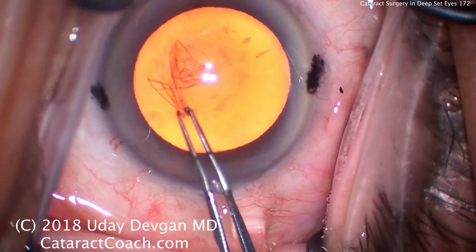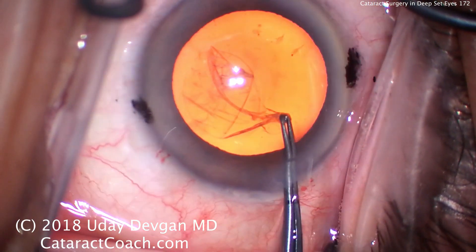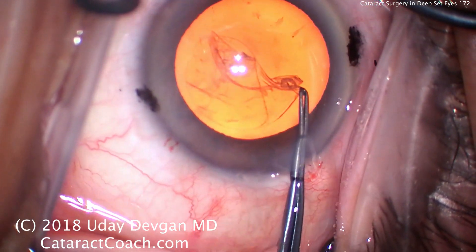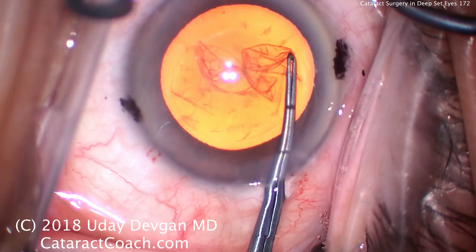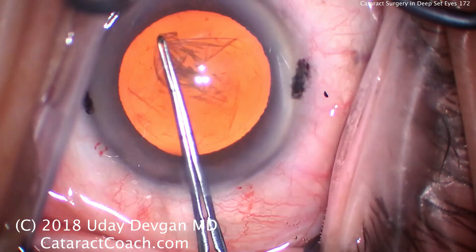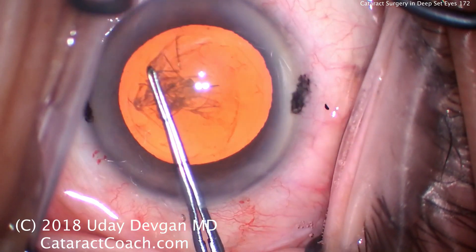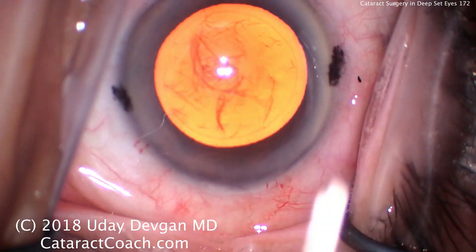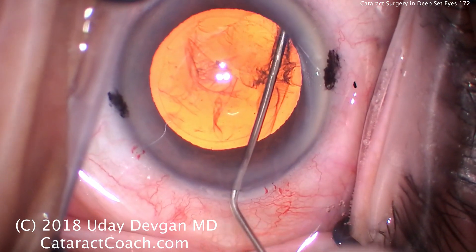So here's our CAPS-REX being made. The patient is really cooperating well. I talked to the patient at this point — I described the lights. I have them look at the lights and I say, do you see those two larger lights that look the same? Then there's one other light off to the side. Watch carefully and you'll see the lights will change on you. That's important to keep the patient fixated on the lights. So we're done there — a little hydrodissection, but let's skip to the end of the case.